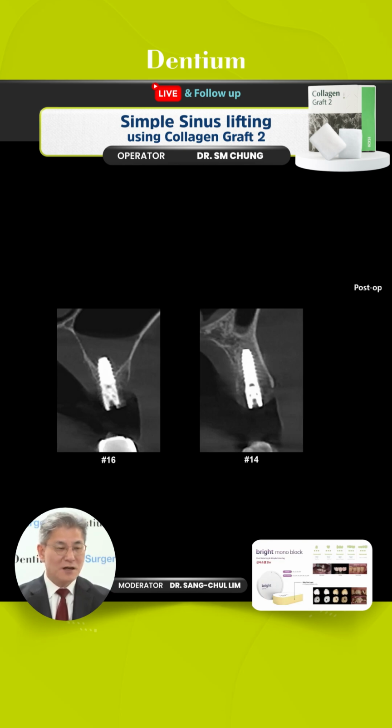So we can expect faster new bone formation with osseointegration on this implant surface area. Maybe these areas will allow faster construction of a temporary with PMMA, with a custom or dual abutment. Compared to this area, what about the 16?